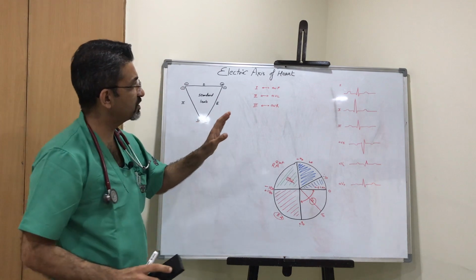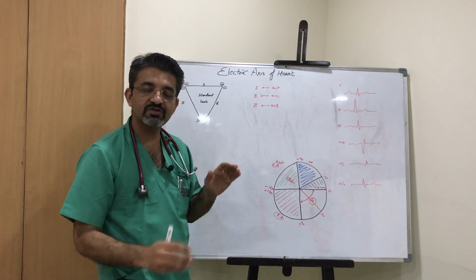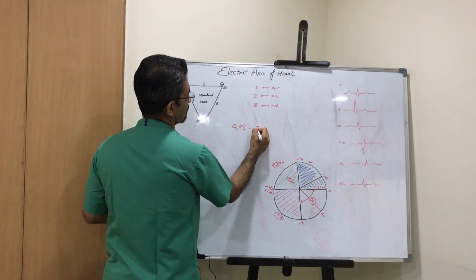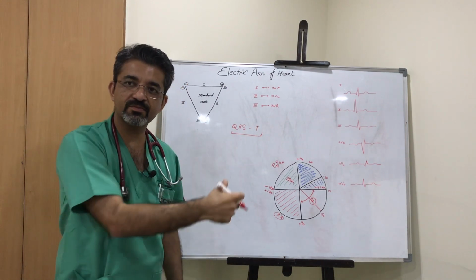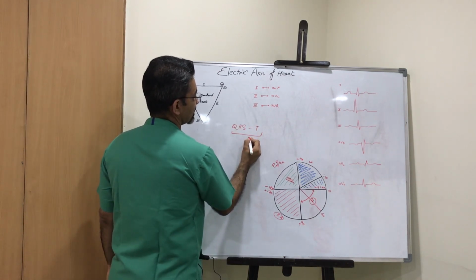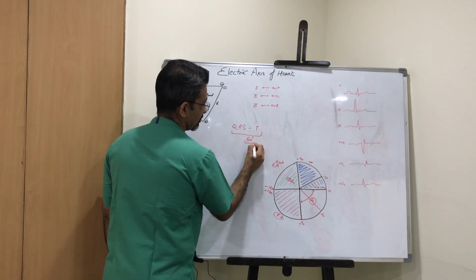You generally don't calculate T wave axis. You generally have a relationship between QRST. It is taken in toto. If someone asks you, can you find with the same principle T wave axis? You cannot. You can say that I have a QRST angle which is 60 degree. I'll not go into detail.